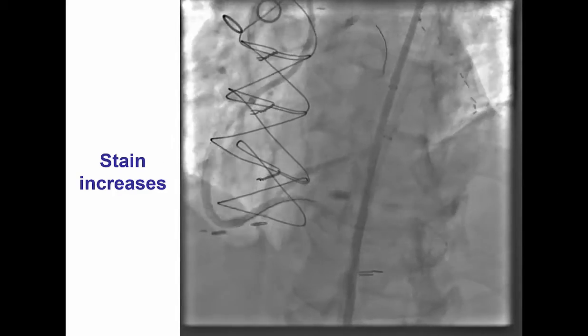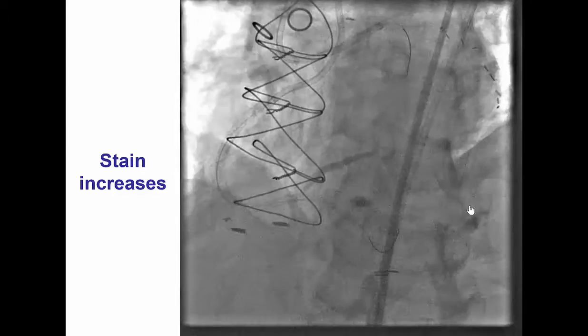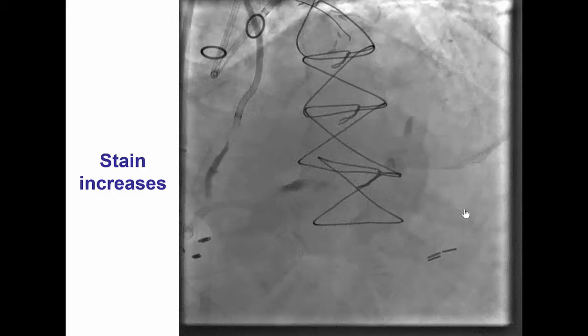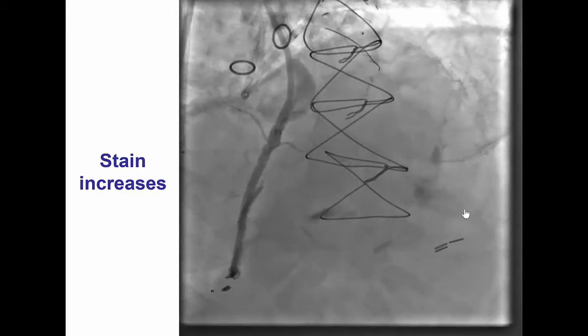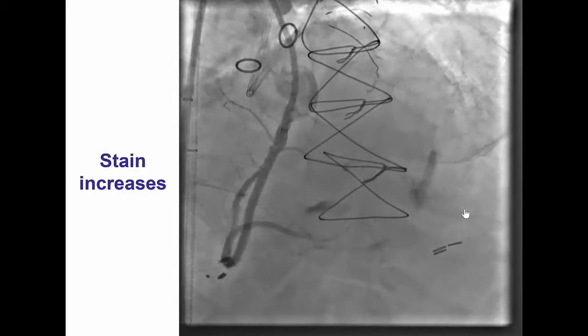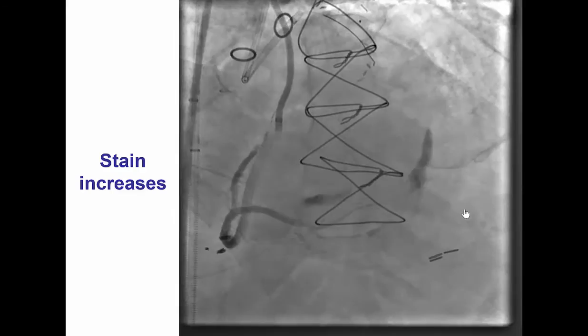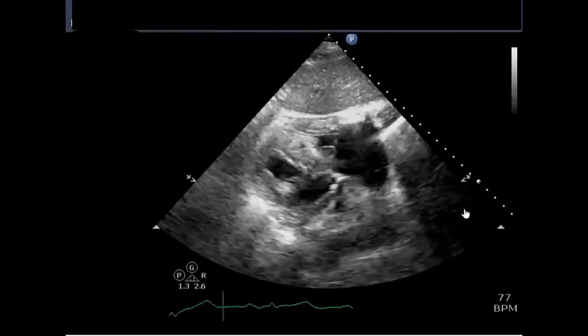However, after stents were placed, we still had the stain and, if anything, it had increased in size. At that point, we decided to treat it.